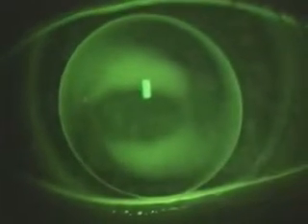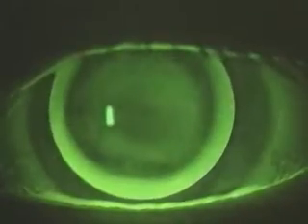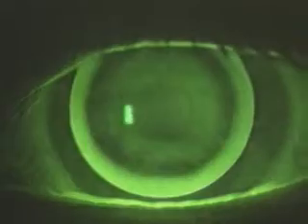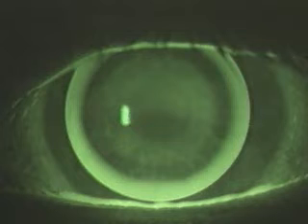In about 20% of fittings, the standard edge lift design will be too tight, producing inadequate width, reduced lens movement, and inferior decentration. This is typically observed with steep, nipple-shaped cones. In such cases, an increased edge lift should be ordered to improve movement and centration. 1 in 10 trial fittings will show an excessively loose edge with too much width and clearance. For these eyes, a decreased edge lift is required.